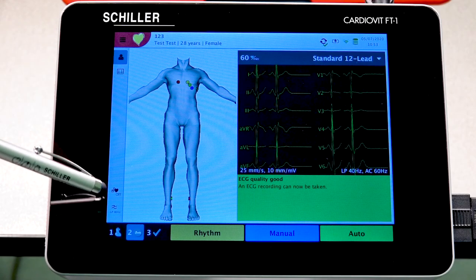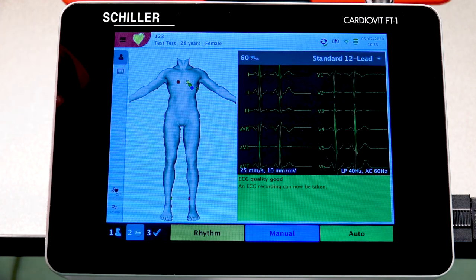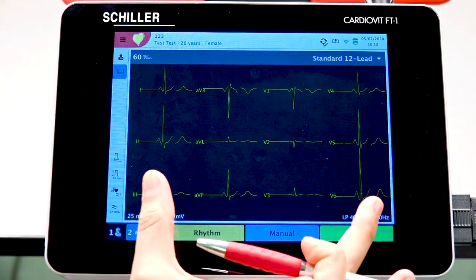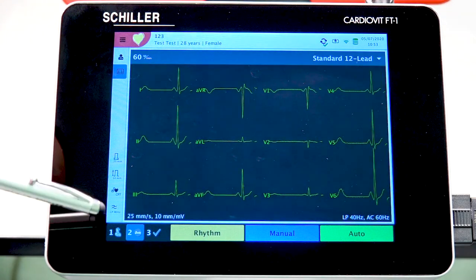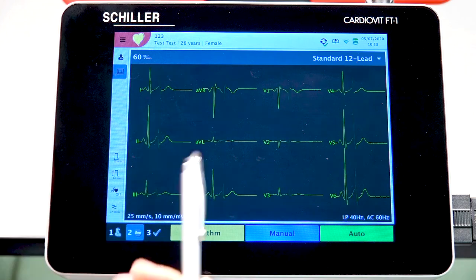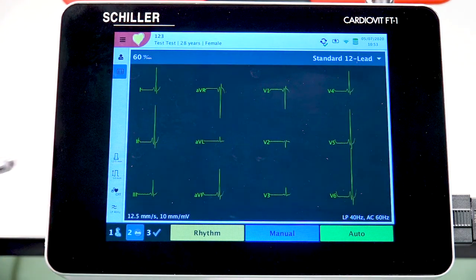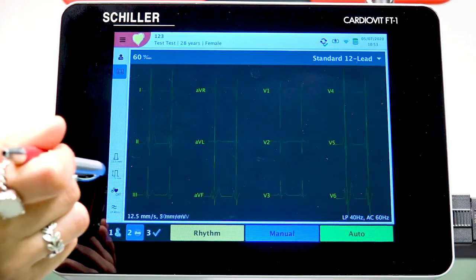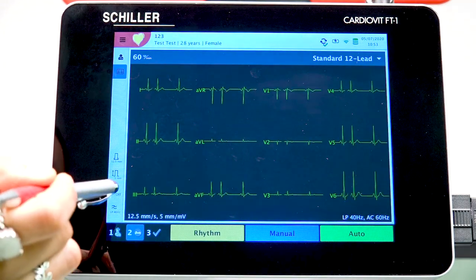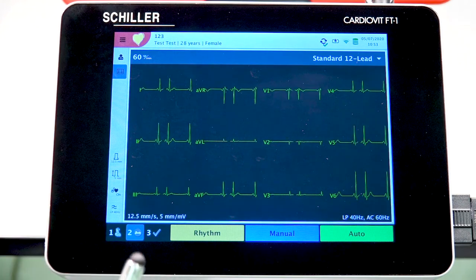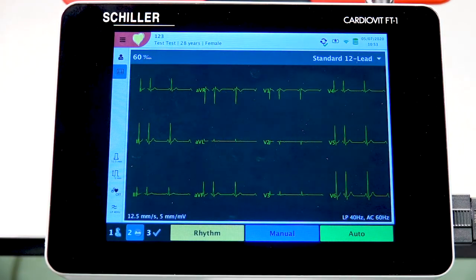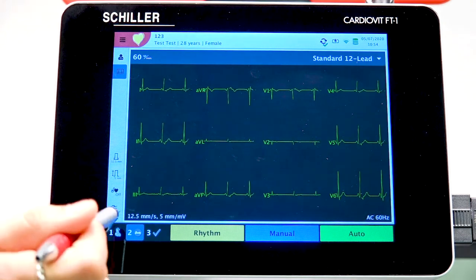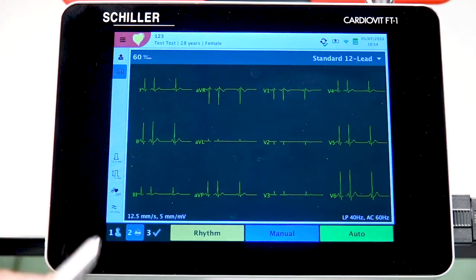On the left, you have a few additional tabs. The second tab takes you to a screen where you can see all 12 leads. You also have settings for waveform speed, amplitude of the ECG signal, pacemaker spike markings, and filters ranging from 25 Hz up to 150 Hz.